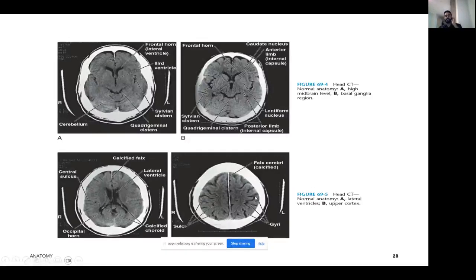Now these are the different levels. I know that it's difficult to remember all of it when I quickly go through them like that. But the point is there are so many things that you can see in a plain CT head. There was no contrast used. A plain CT head can give you so much data. So at the same time, with so much data in there, how do you get to read this? How do we go about reading it?